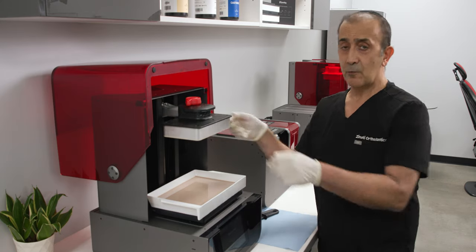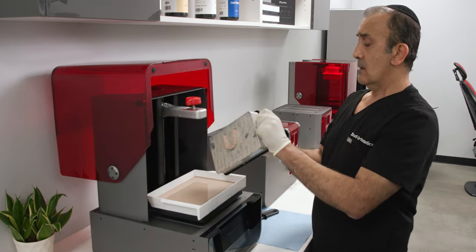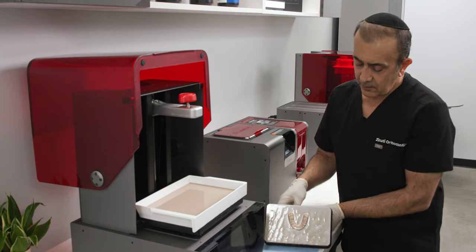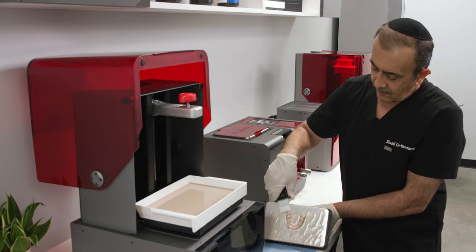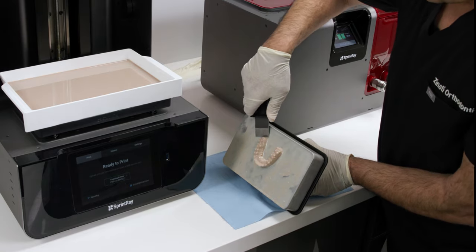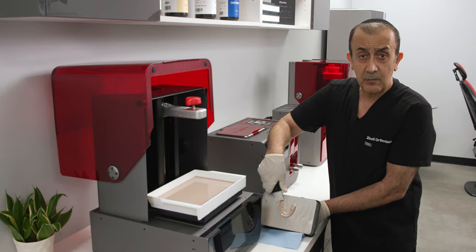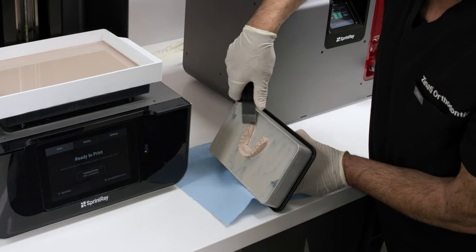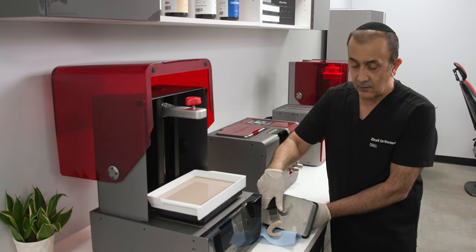The next crucial step is removing the model from the platform. You want to hold the build plate down and engage the models for removal from the posterior area. I just feel my way — I don't want to torque the models and cause distortion because that's going to cause problems with the fit.